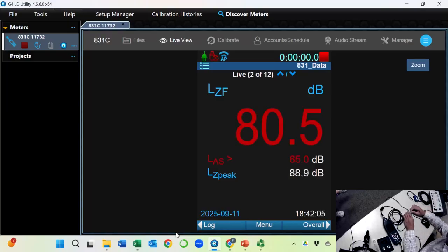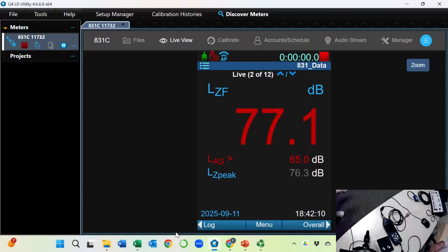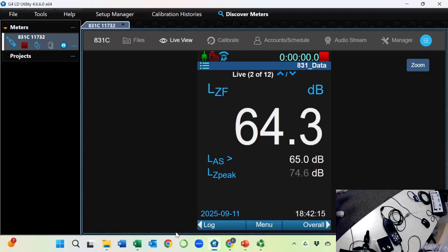Yep. 60 dB is pretty soft, just so you know that, especially for an old man. And it's running around. See? Dr. Jeng, is this mistake number 3? No, I do it on purpose. Just so you will remember it. Because when I was learning how to calibrate, this is one mistake. It took me a while to figure it out.